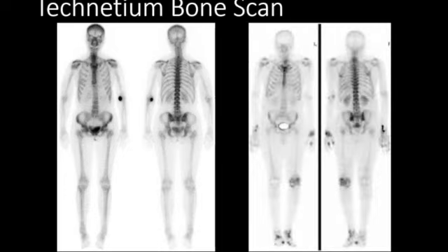At the right of the slide is a patient with degenerative disease. You can see there is more prominent uptake at the shoulders, the wrists, and the left knee. There's also increased uptake at the ankles and at several areas within the feet. These are uncommon sites of metastatic disease and very typical in appearance for degenerative changes.